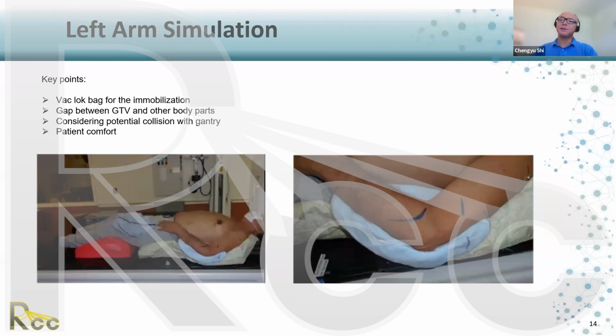For the arms, extremity, leg, arm, anything, you can immobilize it and mark certain key points and make sure the patient does not move. That's all. But if you have the couch that can rotate, the pitch and roll, pay attention to it. You may use it too much and divert the beam into this part of the body.